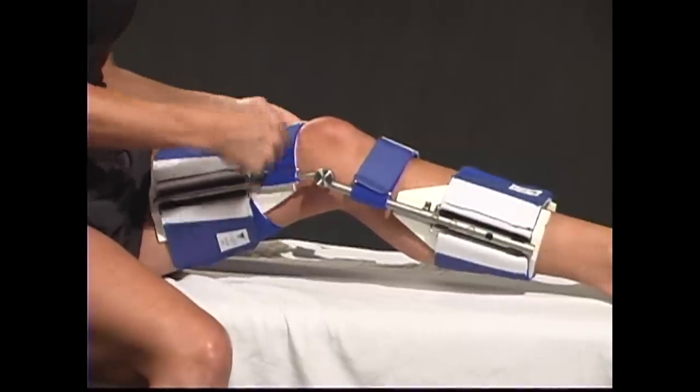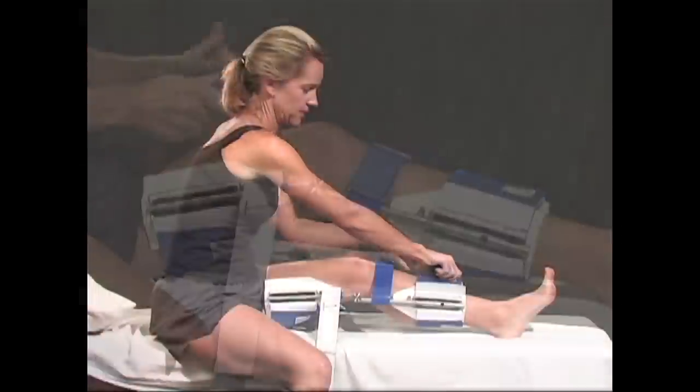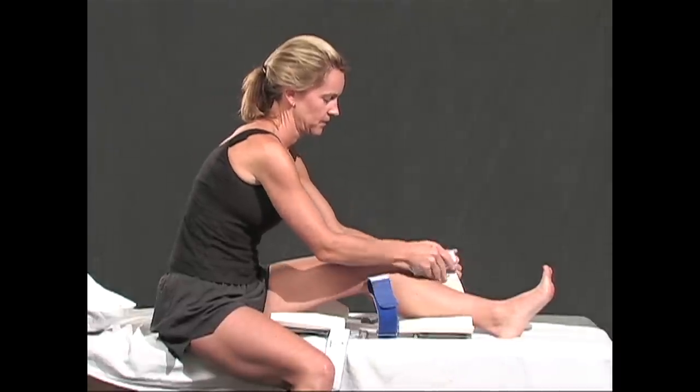In order to remove your DynaSplint, simply open the front straps and cuffs, then slide the splint out from under your leg.